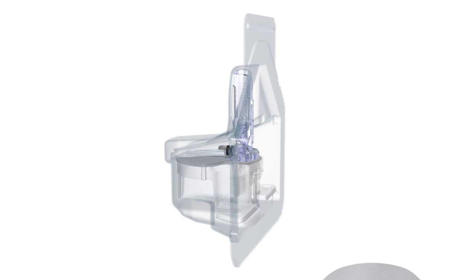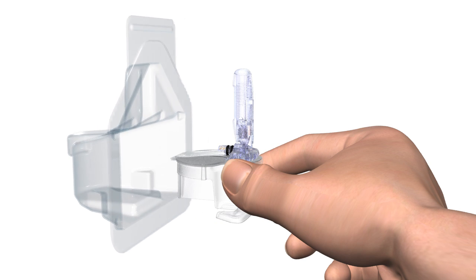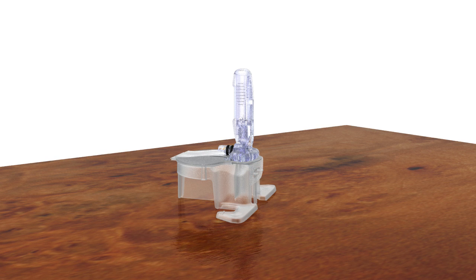Open the Enlight Glucose Sensor Package. Remove the sensor from the package by holding the plastic pedestal. Do not hold it by the sensor or needle housing, as this could damage the sensor. Place the sensor with pedestal on a clean, flat surface, such as a table.